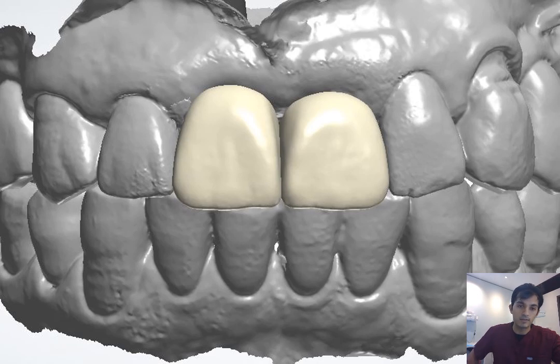It's like sending an email, and in a very short amount of time we have a CAD proposal back that we approve. And there's no sending of any physical models, in particular during these unforeseen times with COVID-19 going on. If we can minimize what leaves the clinic, even if you disinfect an impression, it's still potentially contaminated, and if we can avoid sending those out to our labs and just use a digital file that we know is clean and safe, it's well and good.